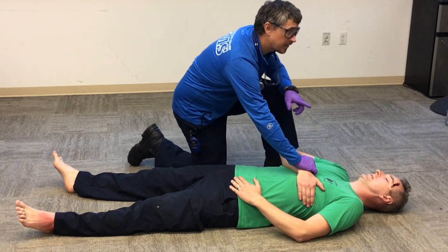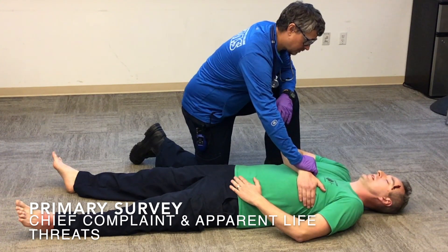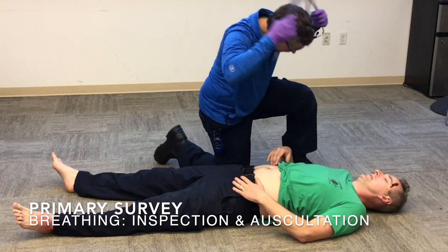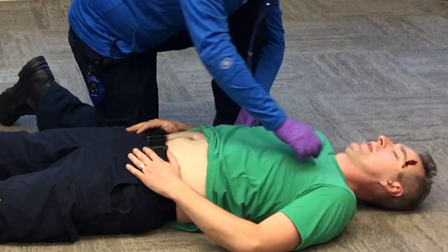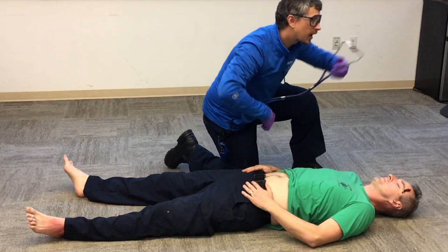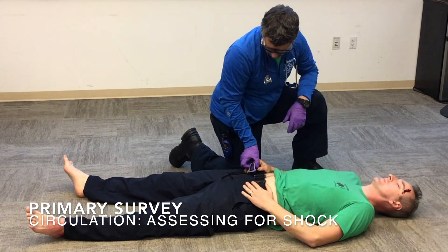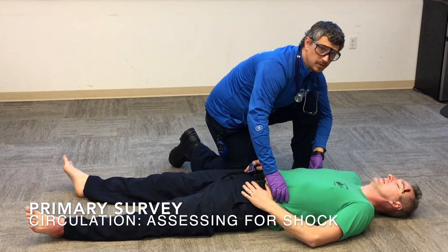Respirations are shallow and labored. We've got a patent airway. Chandlin, can you tell me what hurts the most? It's hard to breathe. All right, can I go ahead and take a look at that? I'm going to listen to your lungs — can you take a deep breath for me? It hurts. One more. Cory, I've got good lung sounds all four quadrants, equal and bilateral. Chandlin, I'm going to put this on your finger. We've got an SpO2 of 96%. Sydney, can you get oxygen ready for me? We don't need it yet, but we'll keep an eye on SpO2 in case it drops.